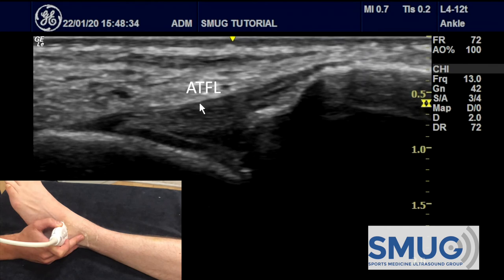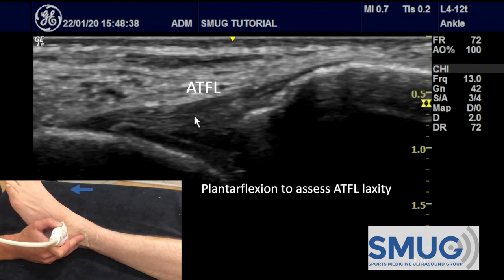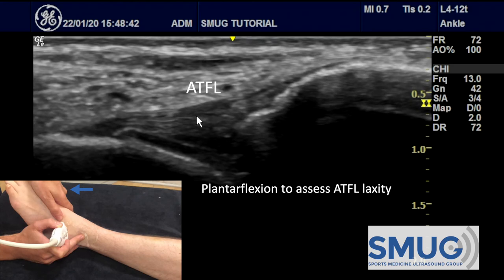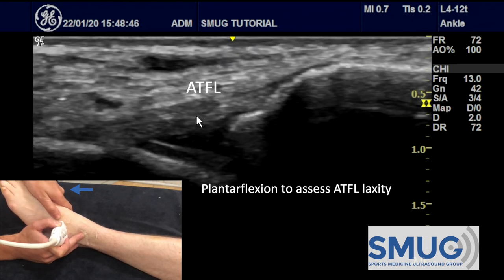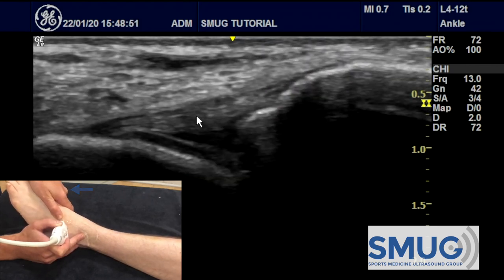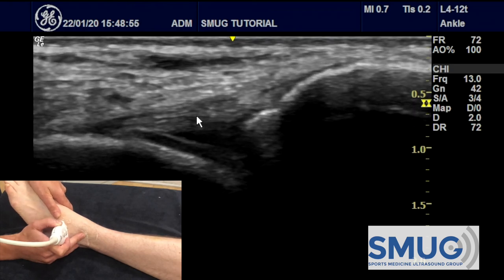The ligament of the ATFL is between here and here. To assess the laxity of this ligament, we use plantarflexion. Make sure you put the thumb nice and close to the probe so you're controlling the foot, and you can see the ATFL going tight and relaxed. So that shows us that the ATFL is still preventing any unwanted movement.